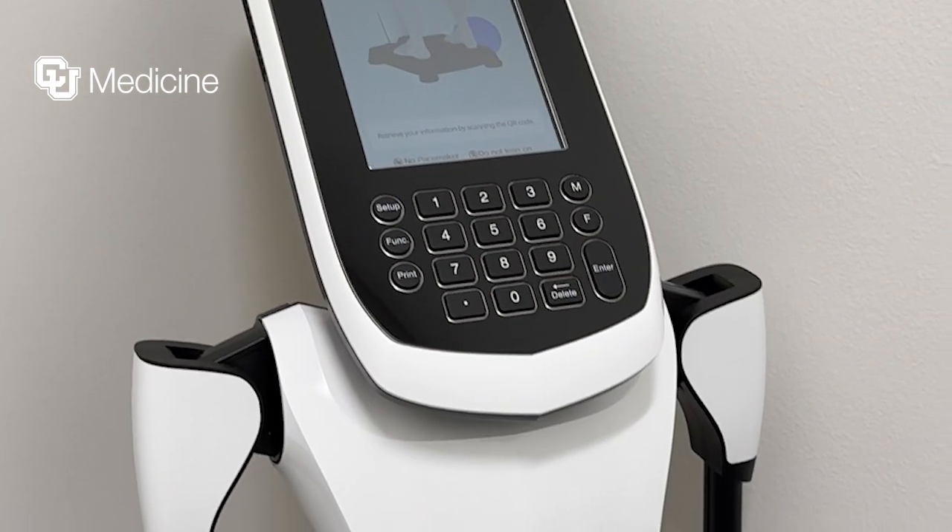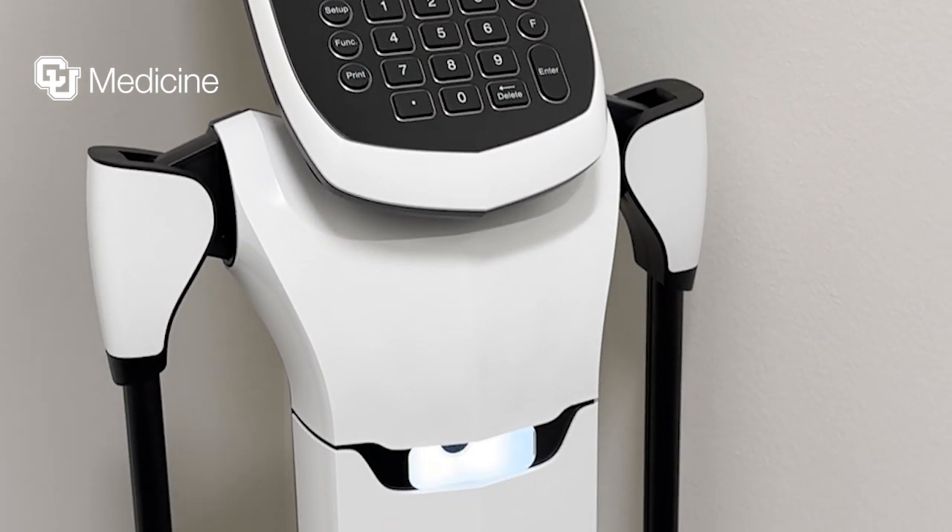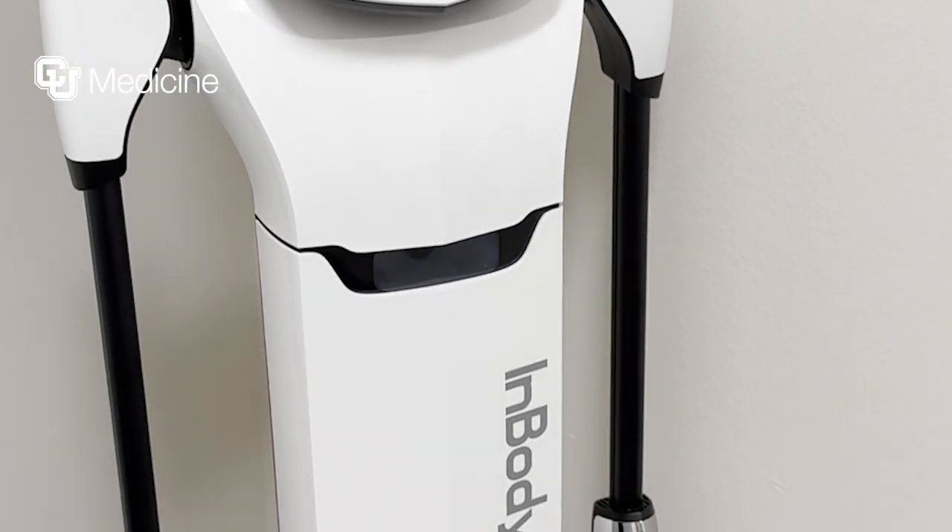This machine is a scale that does more than just tell you what your body weight is. It breaks down your weight into different areas such as your water weight, your lean muscle mass, as well as your fat mass.